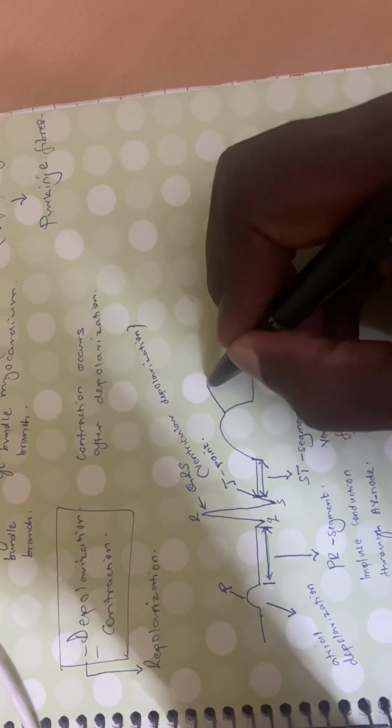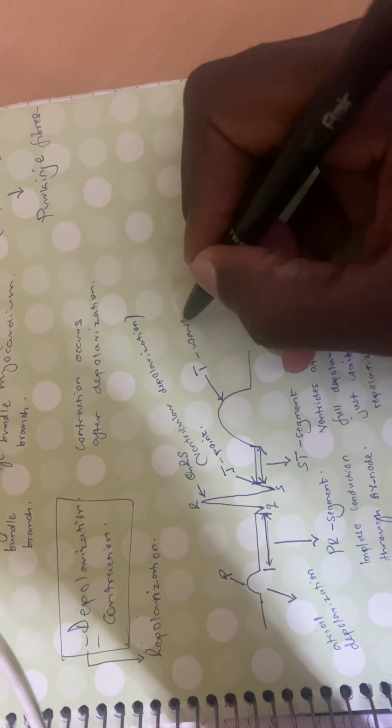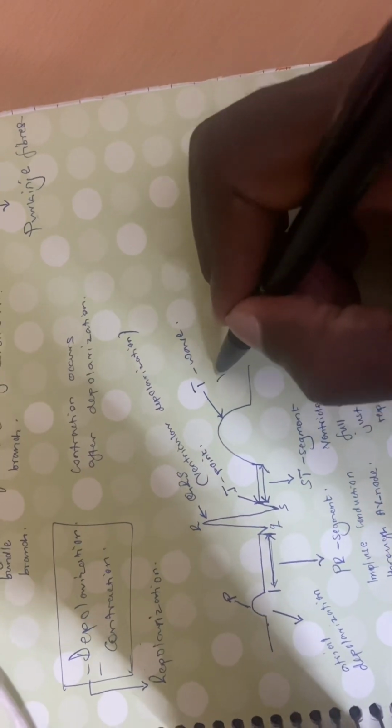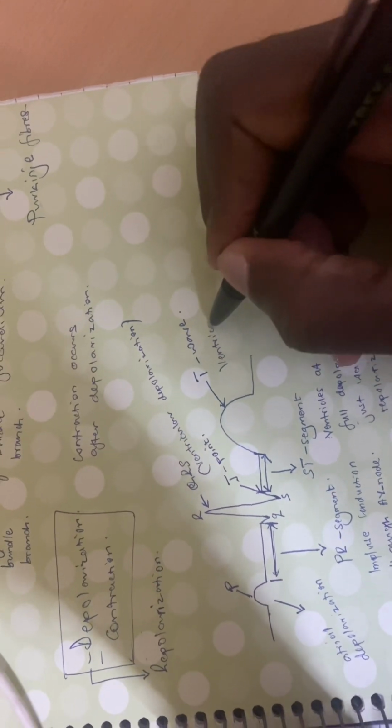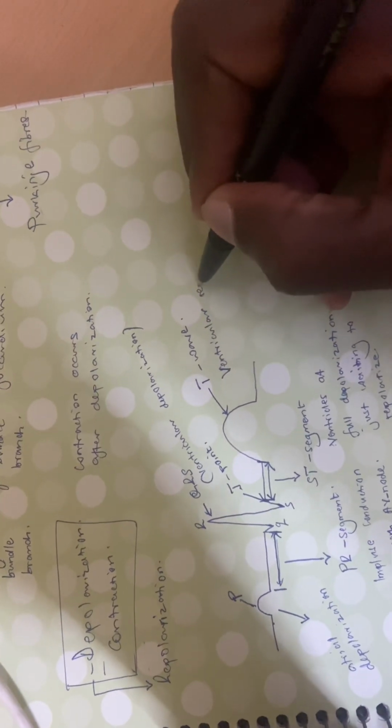Now there comes this T wave, representing ventricular repolarization.